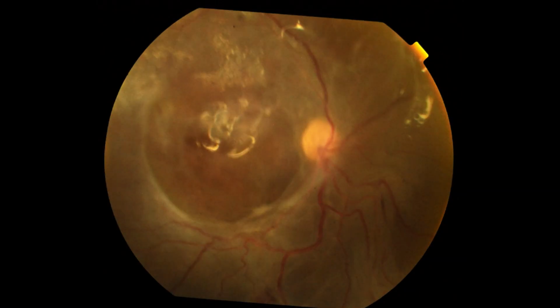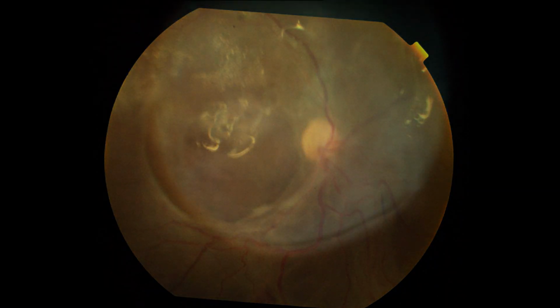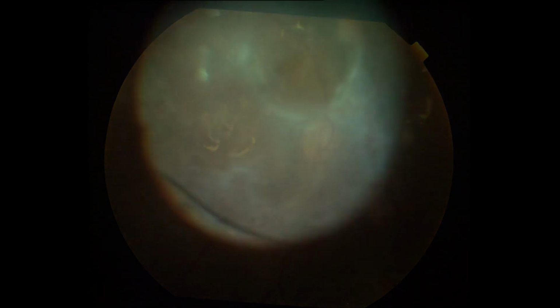The first case is a case of a young male who presented to us with retinal detachment and PVR contraction under oil. The surgeon performed PVR dissection under oil without removing the silicone oil. The infusion was switched off during the entire course of surgery. A 25 gauge grasping forceps was used to meticulously dissect the PVR membranes.